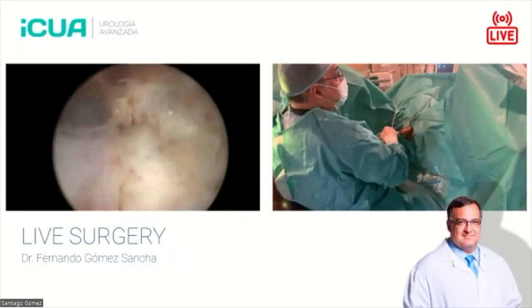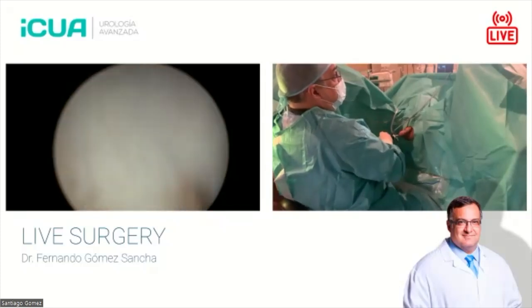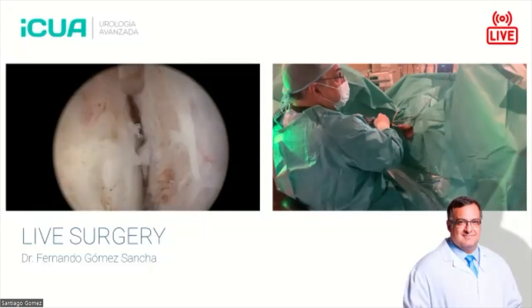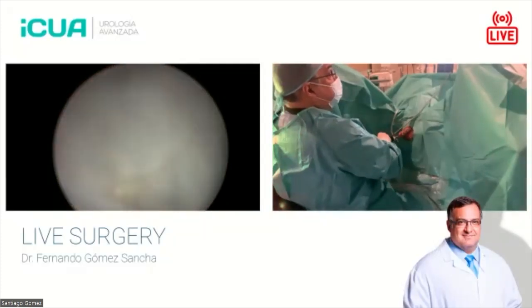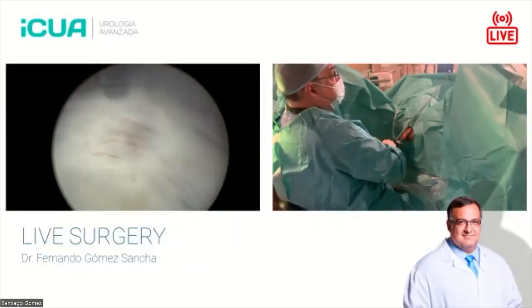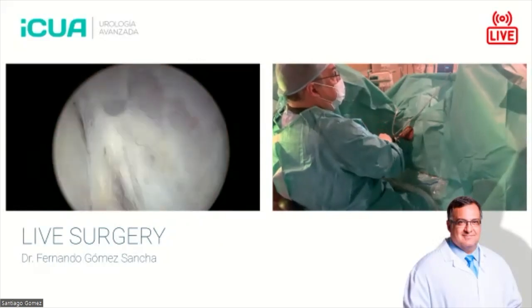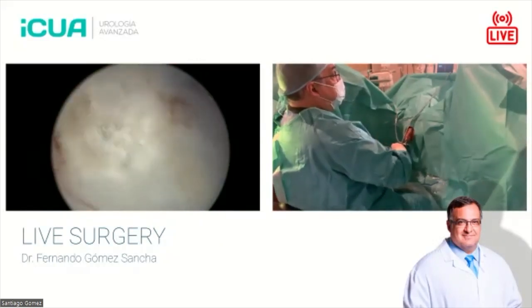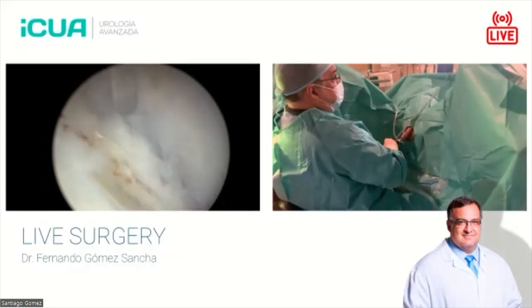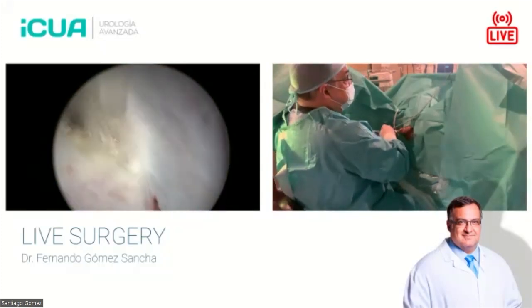I will do another access incision, this time a little bit more horizontal like this. And then this takes me to the proper plane, and I can continue to dissect the plane. You see here, again, I take another 5, 6, 7 millimeters upwards and then towards the bladder neck. This is the progressive mobilization of the apex that is going to allow me to tackle the 12 o'clock area very safely and very consistently.